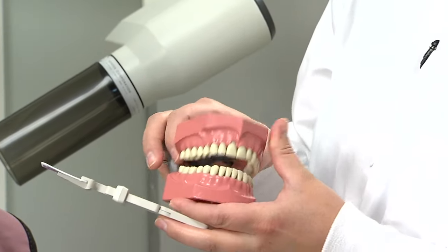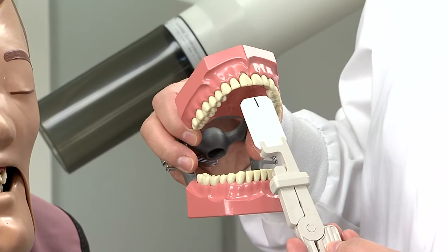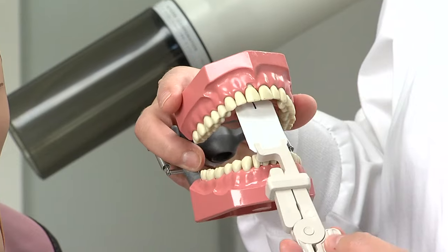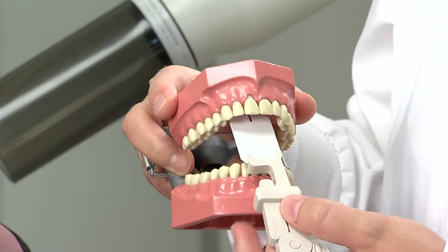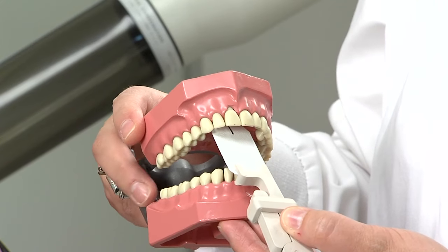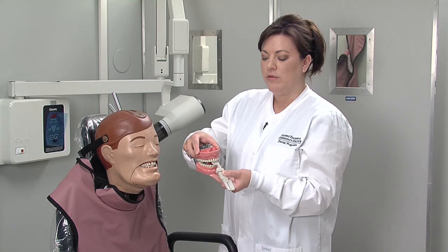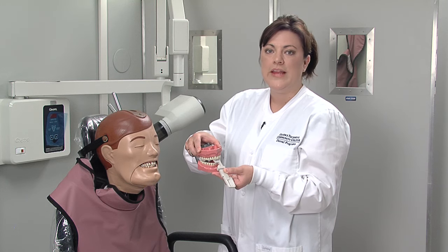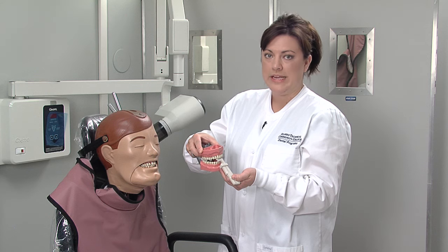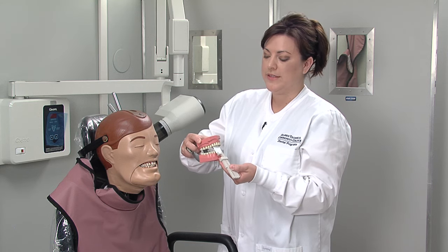Starting with the anterior teeth, the first shot would be the central incisors. We're going to line up the middle of the film at the midline to get both central incisors, and we're going to try to get the film as close to the lingual surface as possible. Remember with the snap array on all the anterior teeth, the patient will actually have to hold the bottom of the film holder — it won't stay in place on its own. This would be for the maxillary centrals.